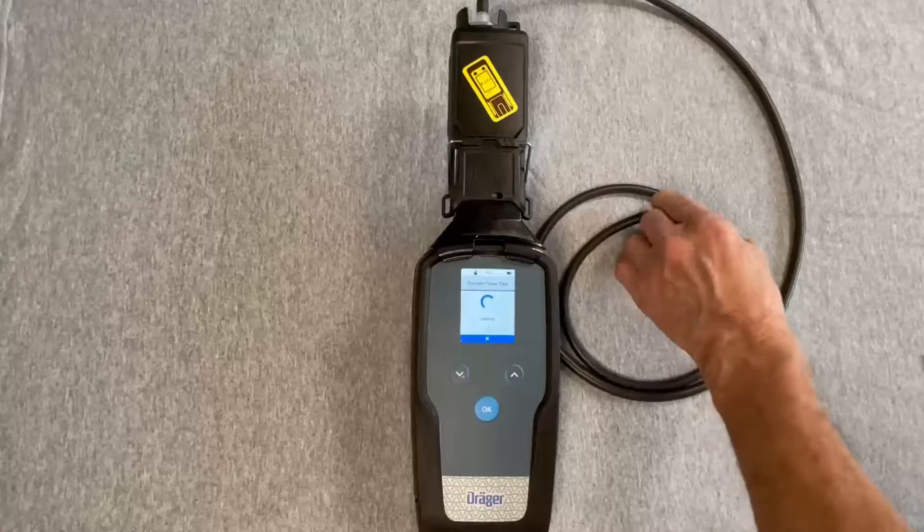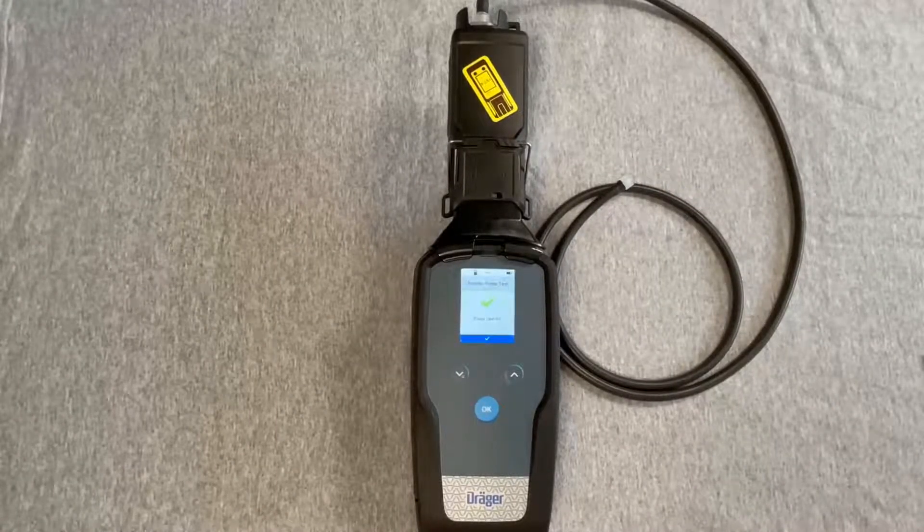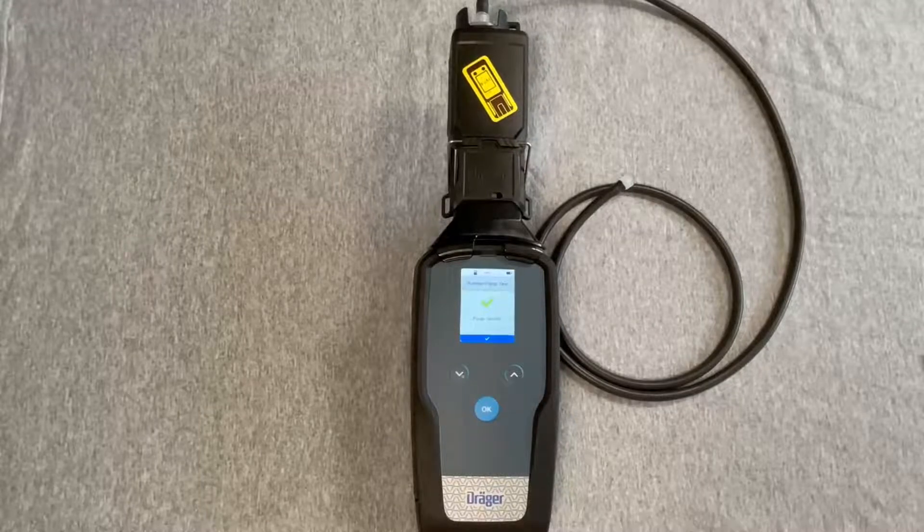Next, the device automatically conducts a test that determines if there's any blockage. If the test is OK, pump test OK is displayed. Press OK.